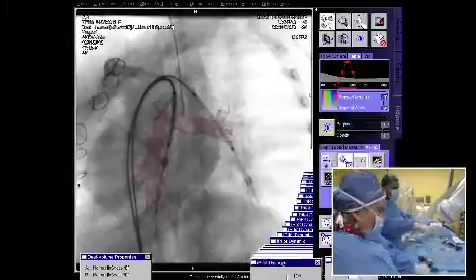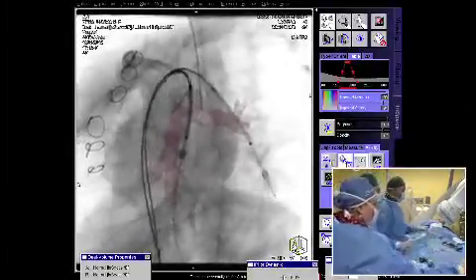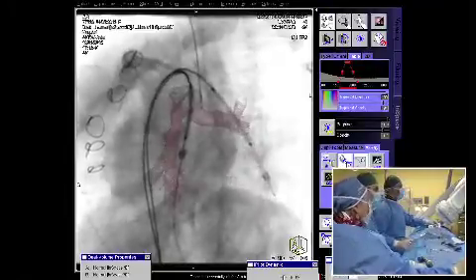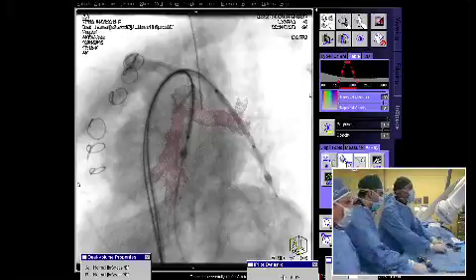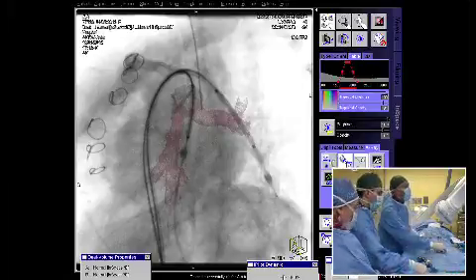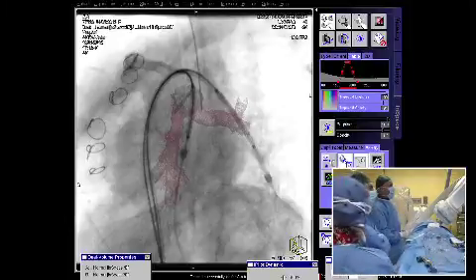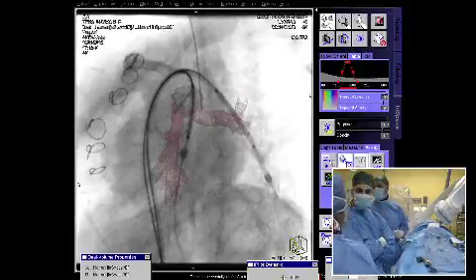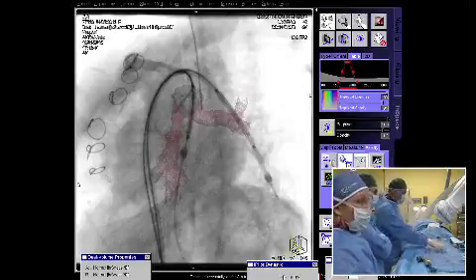But I would guess that we have to be careful not to be even more confused with conventional projection when using it, particularly when we cannot achieve the perfect overlapping of the images. Yeah. Also, when you put a second wire in, I guess. Right? Would you comment? The second wire, you deform the whole anatomy, I guess.